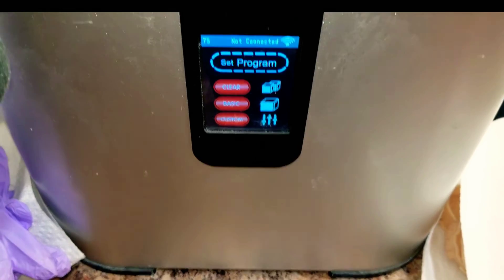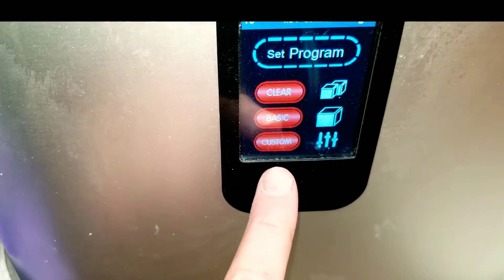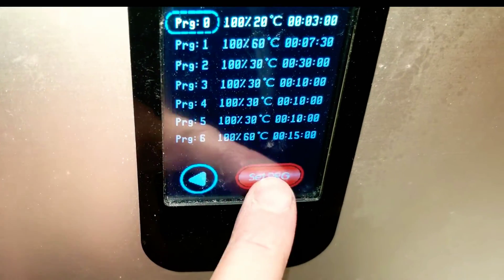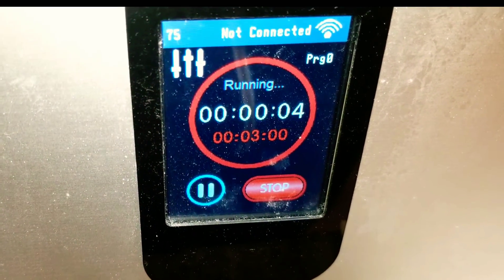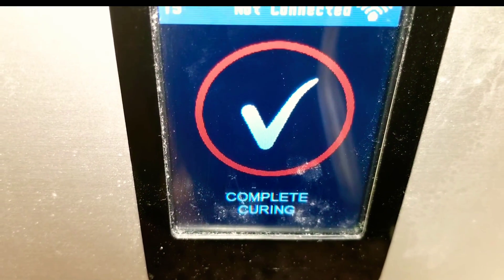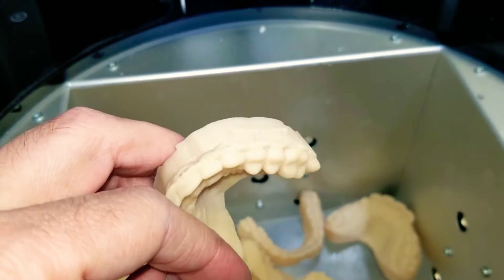This is the last final step: I put these in my PCA 2000 box, hit start, and within three minutes my models will be cured. And there you have it — these models are fully cured and ready to make orthodontic appliances on.